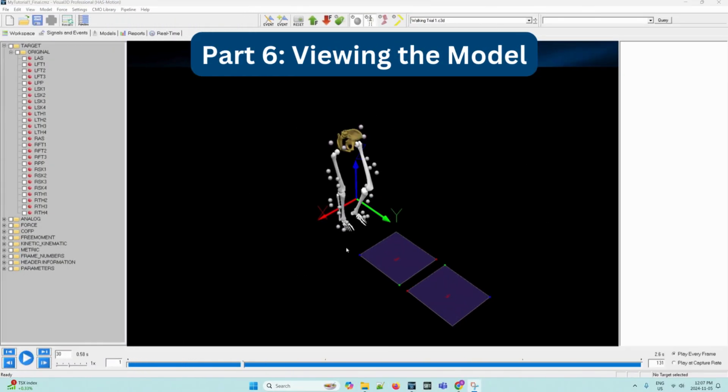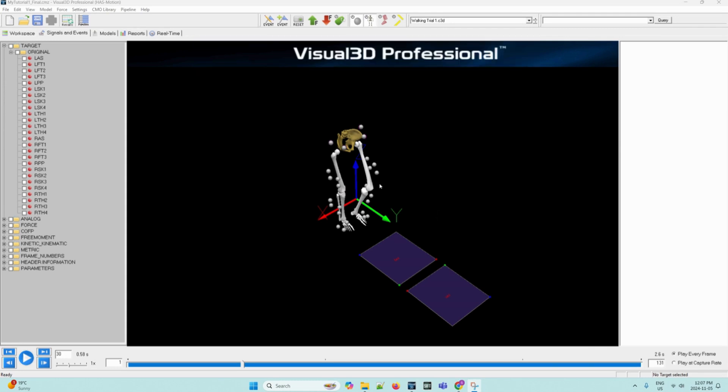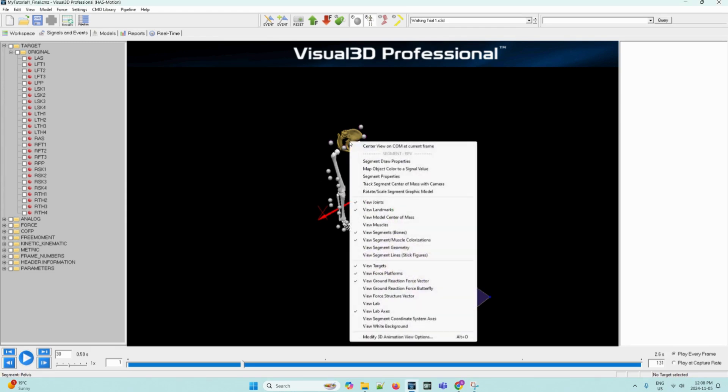Now we can begin viewing the model. It may be useful to focus on specific physical features of the model. We can reset the camera's perspective to lock onto a segment and keep it centered onto the screen. To focus on one segment, we must follow a series of steps. First, we can stop the animation before proceeding. Then, we can right-click the pelvis of the 3D figure, and this will open a list of viewing options. In this list, we can select Track Segment Center of Mass with Camera.